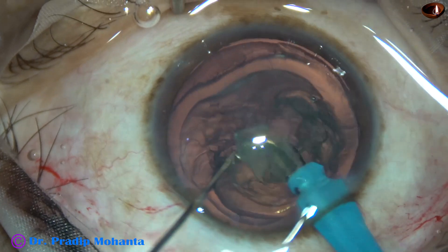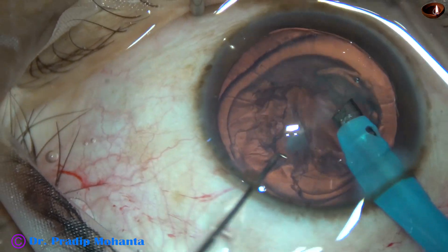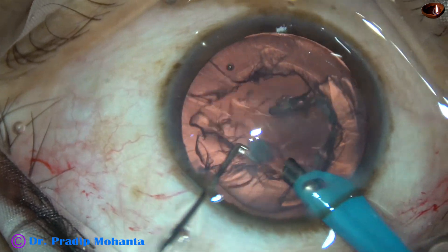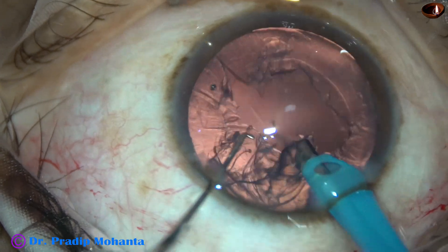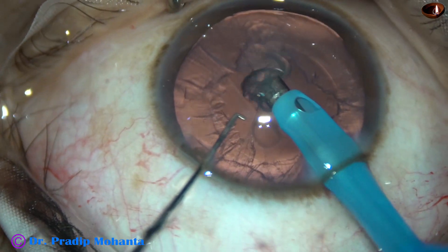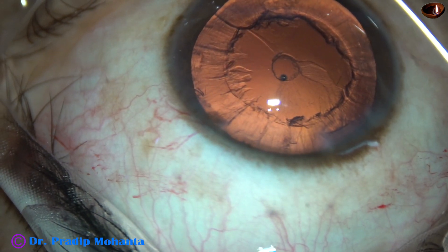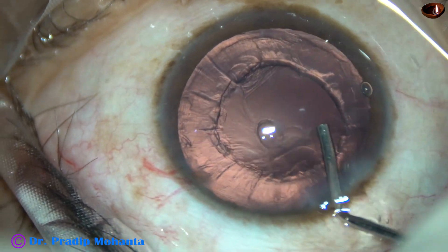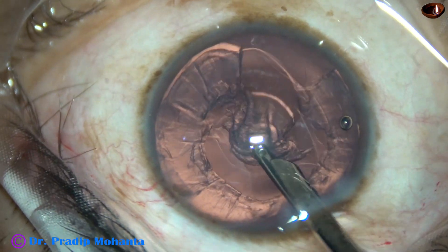I am aspirating the lens mass. This is a very soft cataract and the nucleus is being aspirated. It is almost done. We can see a small opening at the center — that is an opening in the posterior epinucleus or posterior cortex — and the posterior capsule is intact.